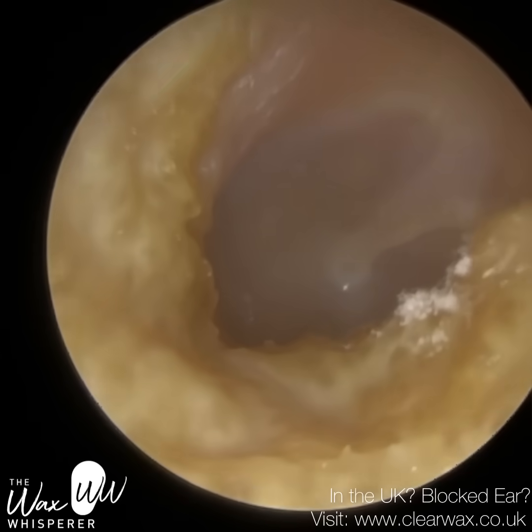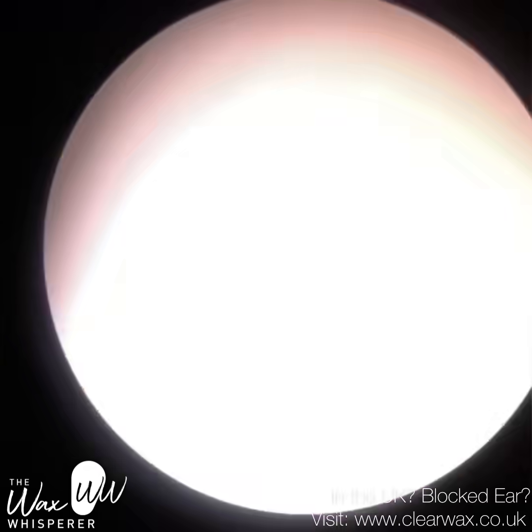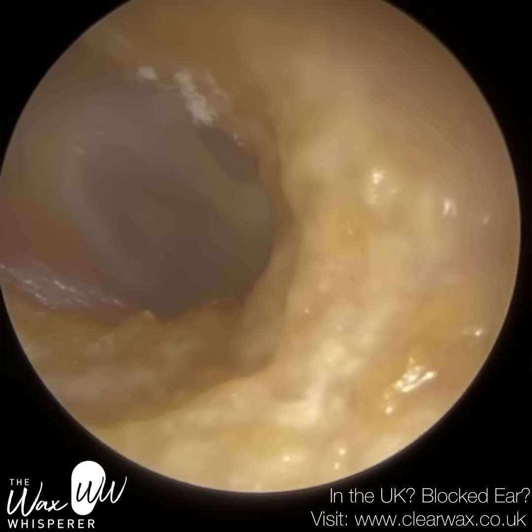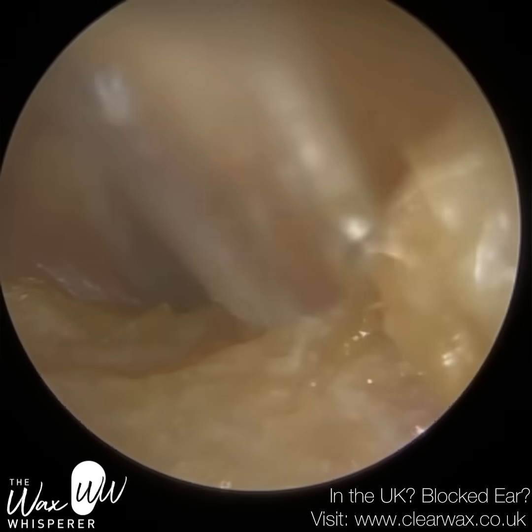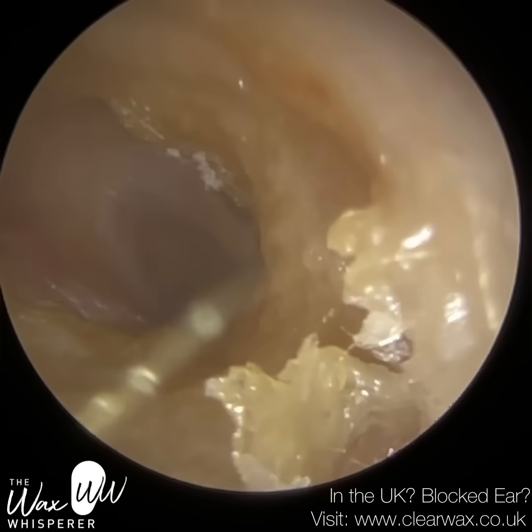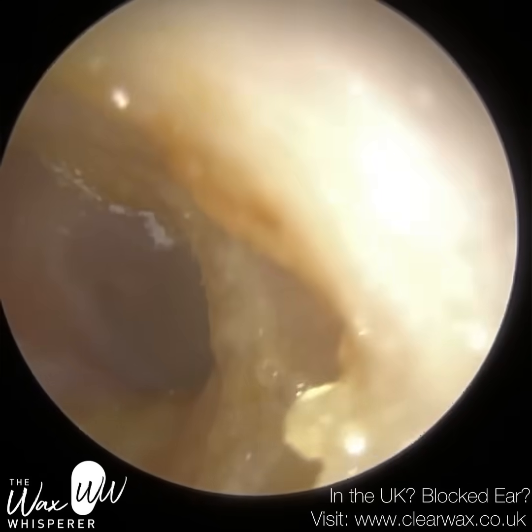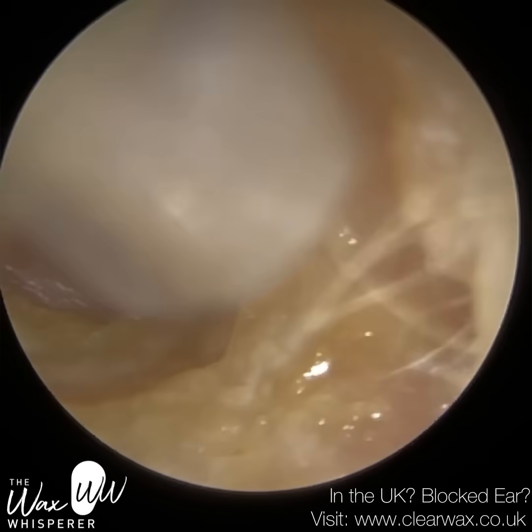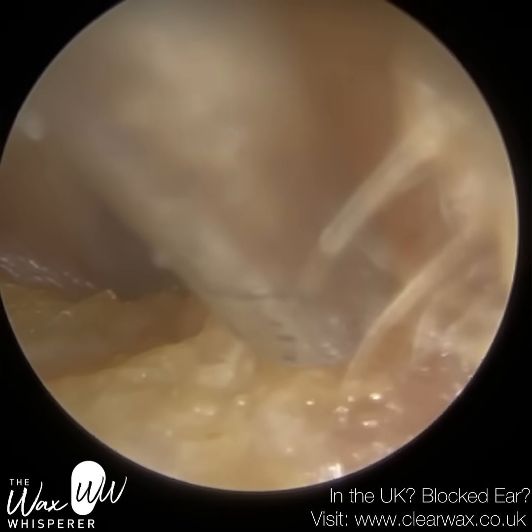This is a patient who was suffering from a fungal ear infection. You could see some woolly strands there called hyphae. We already know by the presence of that hyphae and woolly strand appearance that they had, and still have, Aspergillus. It's different strains of Aspergillus, but it's a strain of fungi that are actually native to the ear, believe it or not.